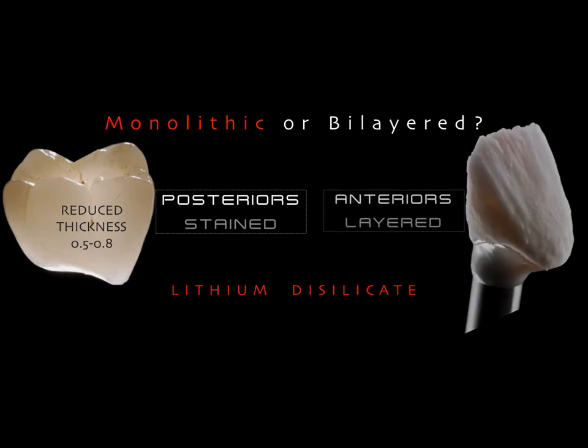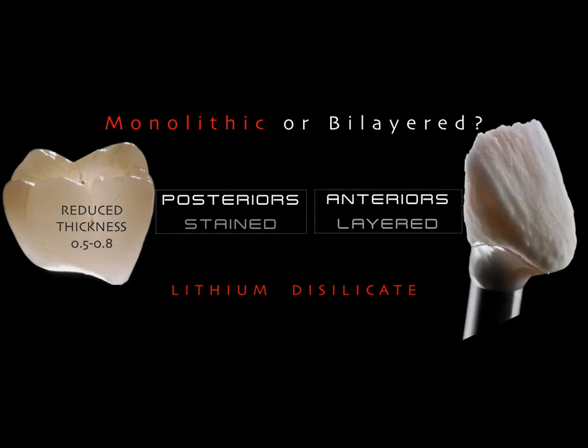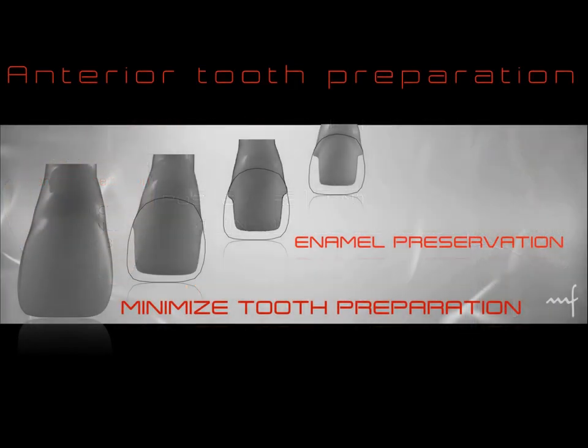In this case, using lithium disilicate, you can also have the chance to layer it anteriorly to optimize the aesthetic result, even though you can also use just the monolithic even on anteriors to really be sure 100% about the strength that you achieve at the end. So basically, anterior tooth preparation was really changed over years. In the 90s, maybe that was the normal preparation modality and thickness. But then we started to prepare less and less. And today, I can say, we really minimize tooth preparation this way, just removing the undercuts and keeping as much enamel as possible. That's the point.